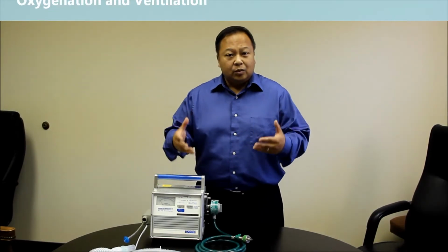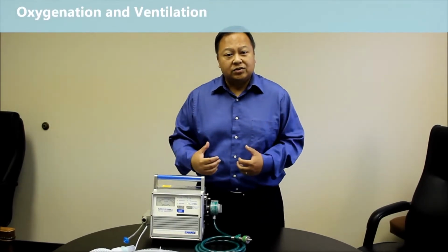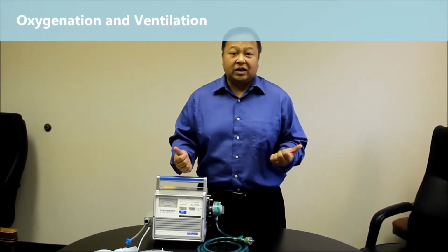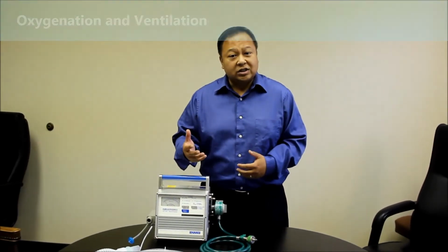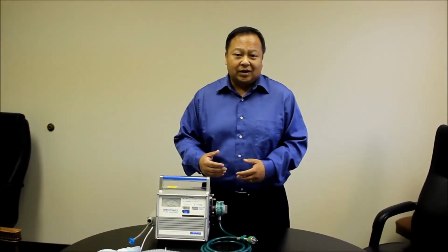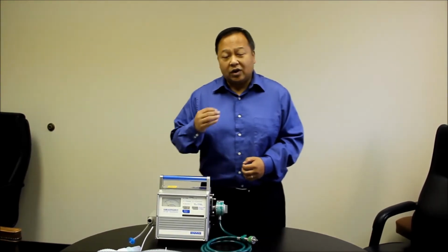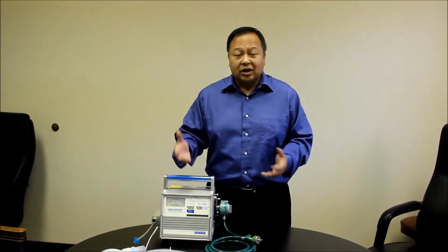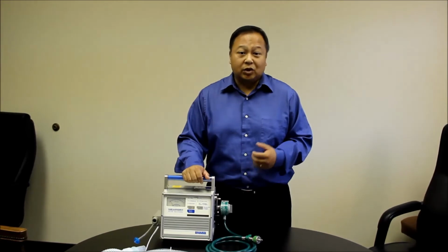So first off, why are patients being placed on a ventilator? When we're talking about ventilation, we're talking about the lungs. What is the function of the lungs? To provide oxygenation and ventilation. If a patient is not oxygenating well, what do we do as nurses? We provide them oxygen, and hopefully by providing oxygen, it'll increase their oxygen levels and they'll be fine.